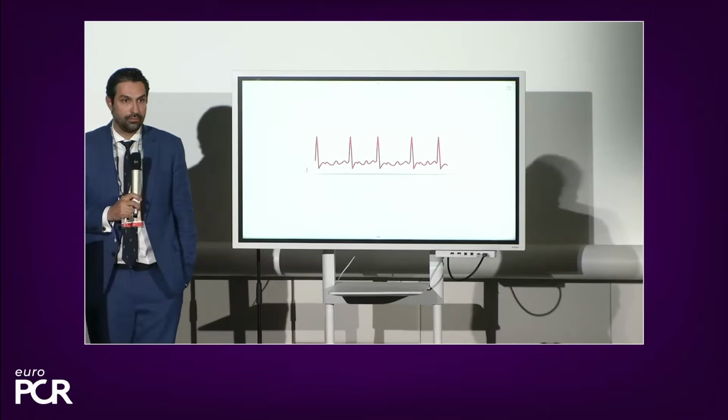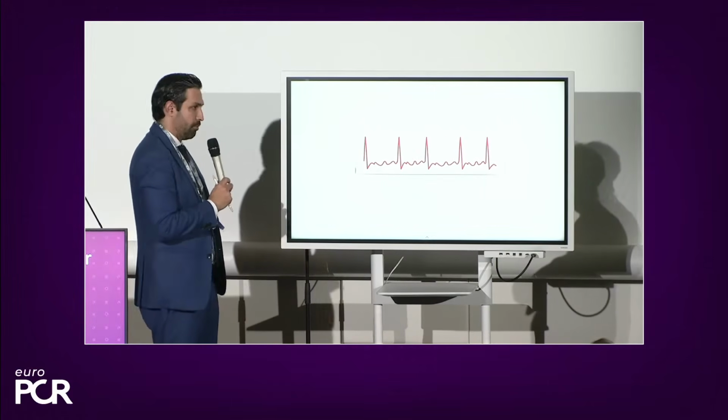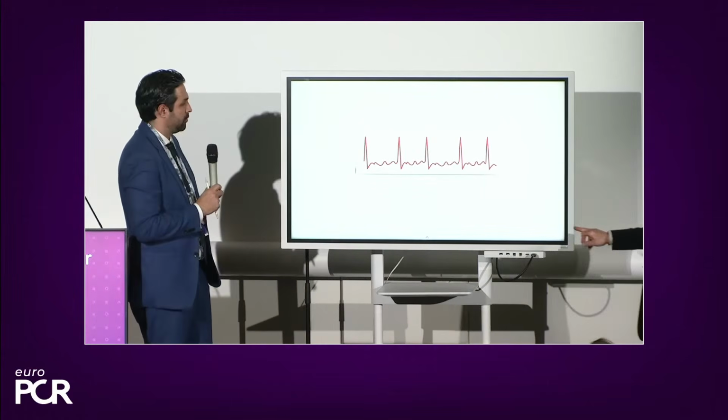Rhythm. Is atrial fibrillation going to be an issue in the acquisition? Short answer, not a problem. Okay, no problems with atrial fibrillation.